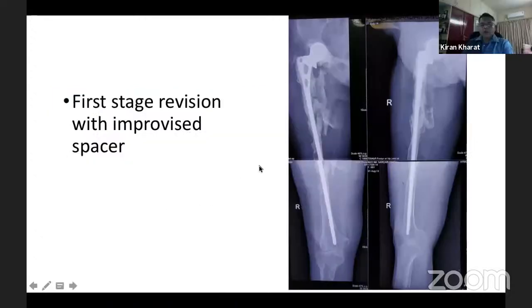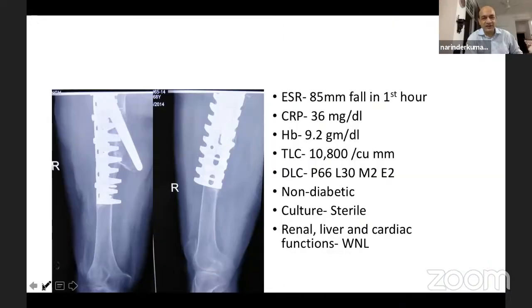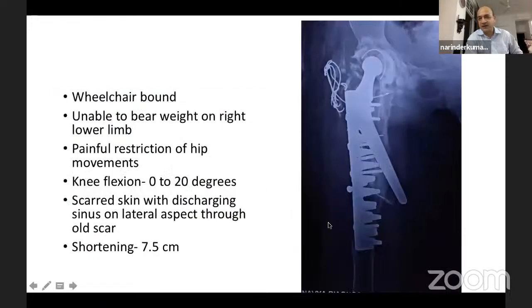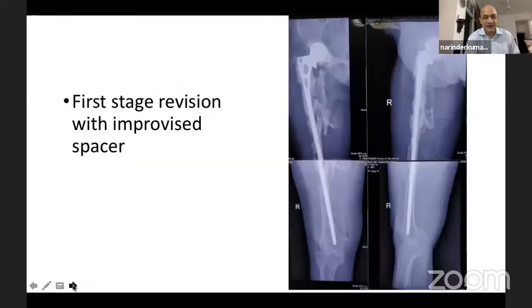That plate is called a Menin plate. I was getting there. What is surprising here in this Menin plate was that the plate is a titanium plate. They withdrew it about 15 years ago, but the screws were steel screws by whoever was the surgeon who did it. He put steel screws with a titanium plate, but it worked for 10 years. So whether that was electrochemical battery going on there, I don't know.